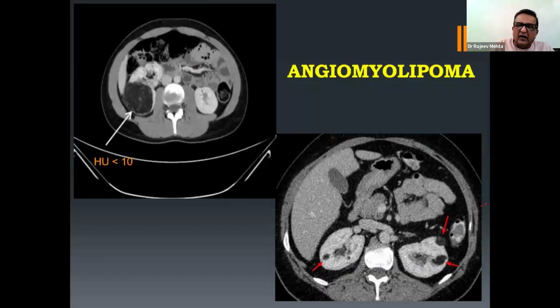Angiomyolipoma is relatively very easy to pick up on CT scan because of its fat content. Even small lesions, like sub-centimetric size tumors, having a classical fat content, which has the same density as the rest of the peritoneal fat.